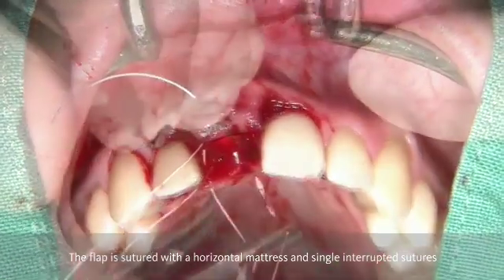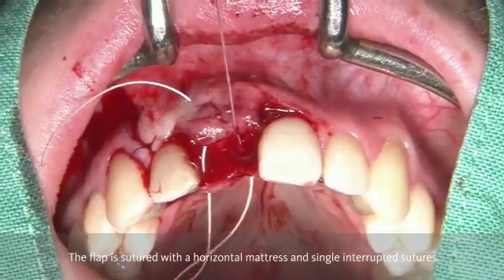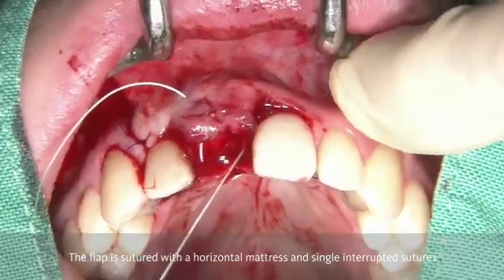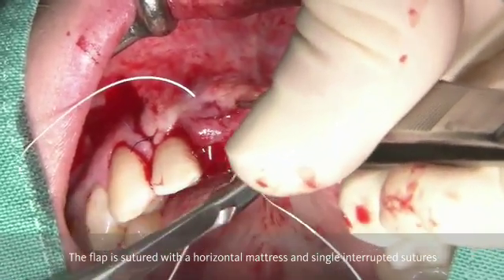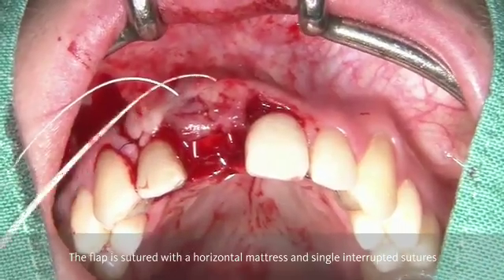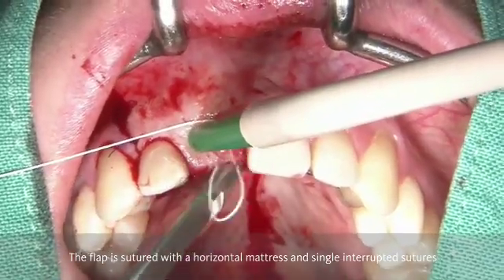The ePTFE suture material has great elasticity, being very gentle to the wound. And this suture is important in order to keep the wound margins together. You can see here the horizontal mattress which is going to be performed. Like this, we are going to bring the wound margins passively together.